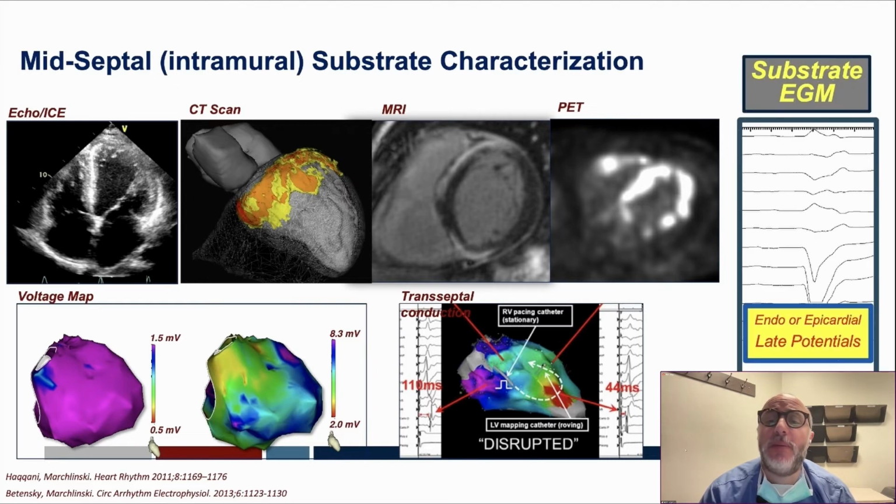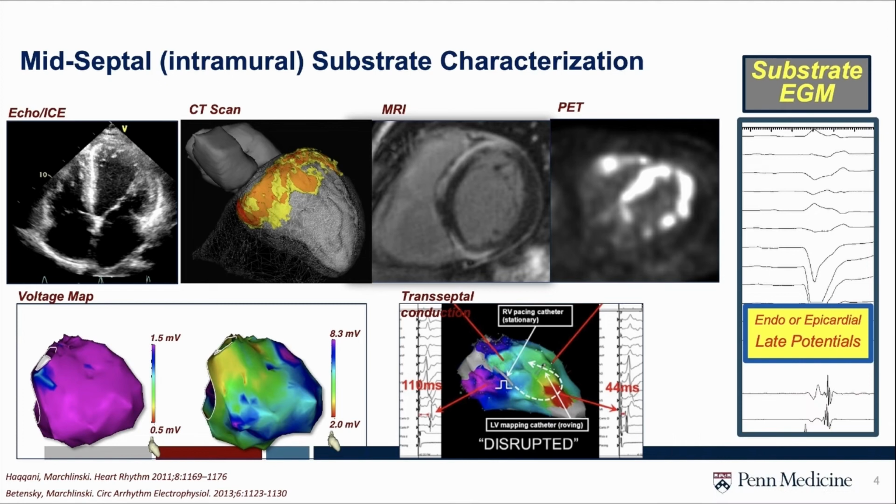Now, I bring this up because in electrophysiology, the real EP characteristic of substrate is the recording of electrograms with delayed activation, so-called late potentials, LAVAs, etc., in which you have the far field signal when you touch the tissue with contact mapping, and then you have delayed activation in that tissue you're touching.